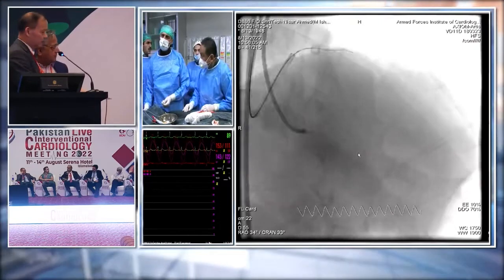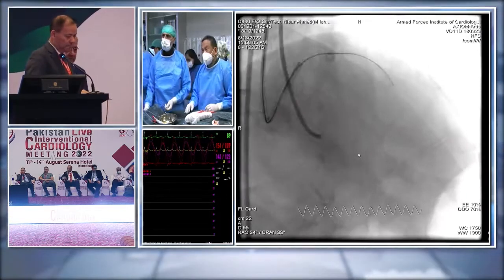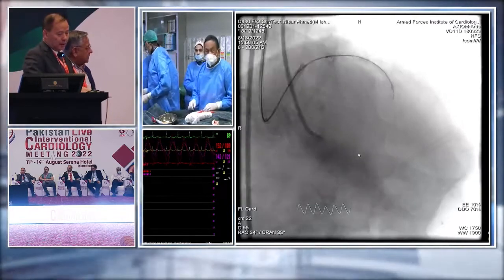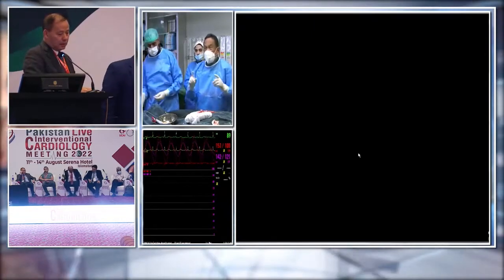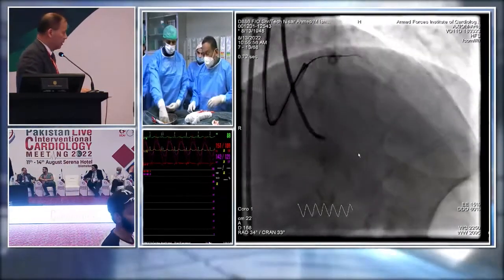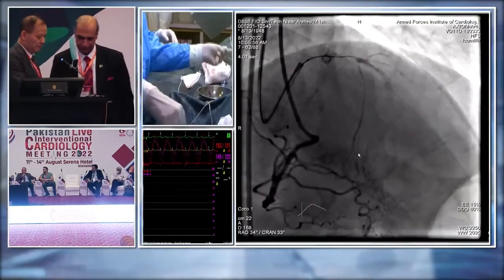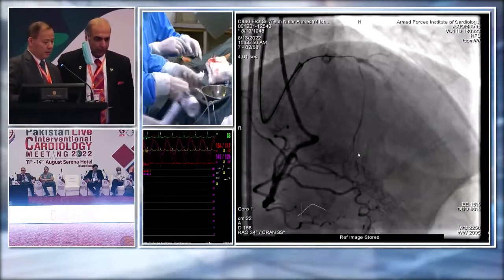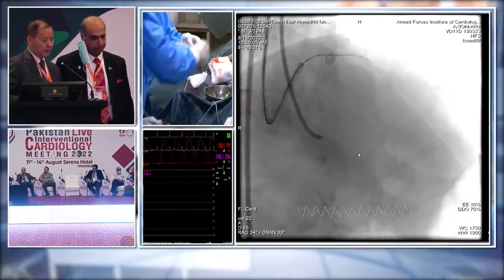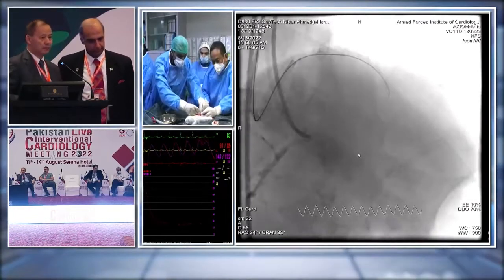Do you need to use a small balloon? Because since your microcatheter has already gone through, you have already done a small balloon job. No, the microcatheter did not go through, so we're going to use a small balloon for that. Also, if the microcatheter had gone through, I would be comfortable using a 2.0 and even a 2.5 balloon, but in this case, it didn't. So we are going to trap, and we're going to use a small balloon to open up the CTO, and we'll see. It didn't go through. Also, Dr. Rosli, because the wire is in position, I suggest you can use a Guidezilla to support the balloon.